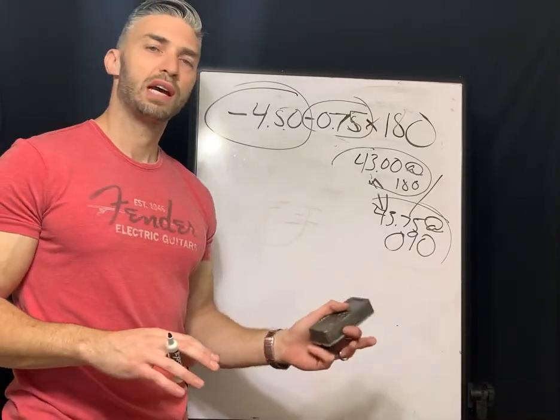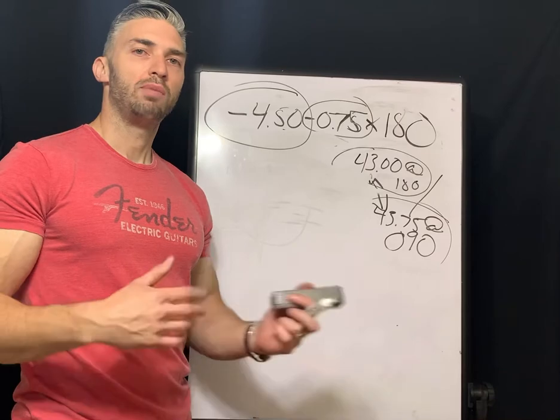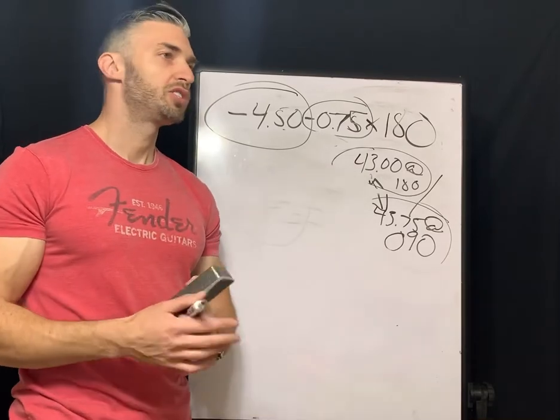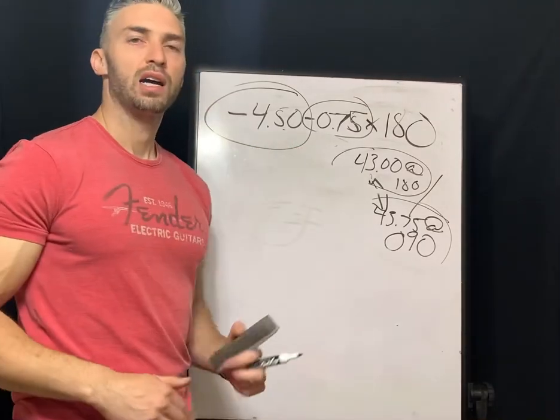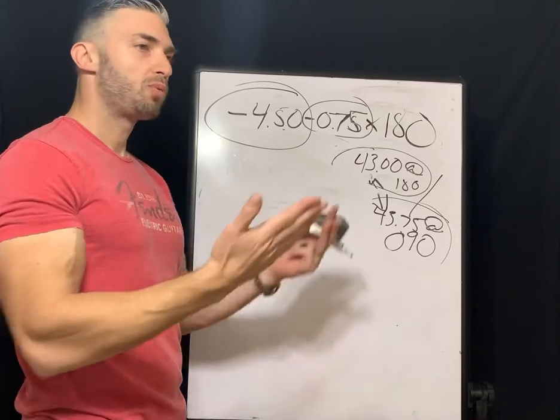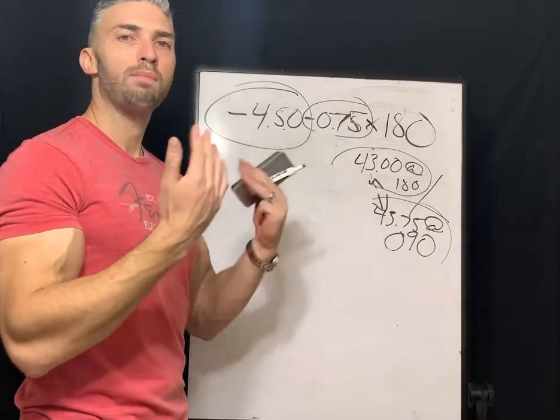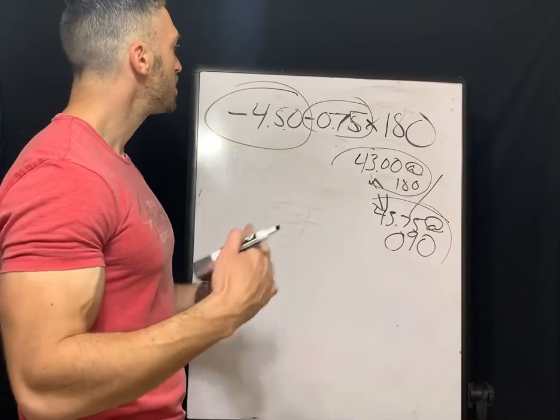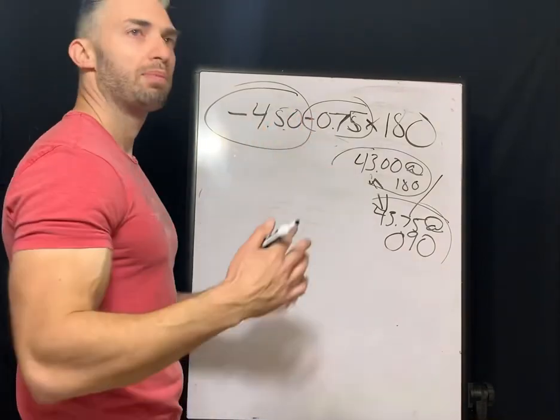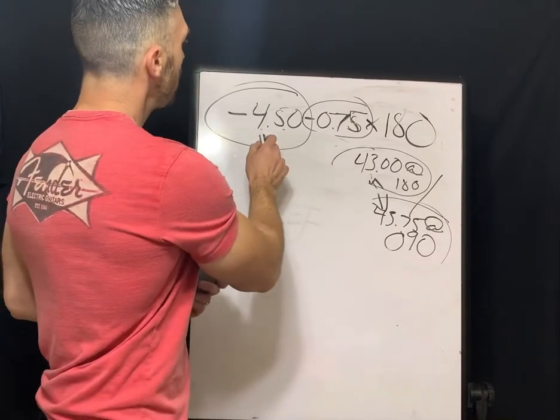I have a couple videos on vertex distance, 2 or 3 videos, so I'm not really going to labor over that point. But I will say, just as a reminder, all contact lens prescriptions are more plus or less minus than the refraction. So if someone's refracted at a minus 450, that's what they got in the phoropter, which is about 12 millimeters away from the eye. So when we're putting that lens on the eye, your contact lens prescription is always going to be more plus, less minus. You're not really going to notice much of a difference at 450 as your diopter, because it's going to take up to about 9 diopters to really make a huge difference where you're changing even a full diopter potentially. So we're going to go just a little bit.